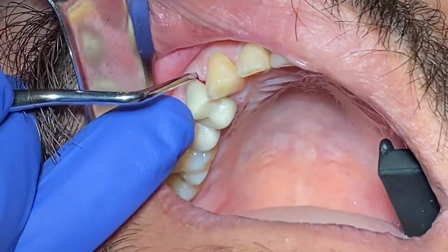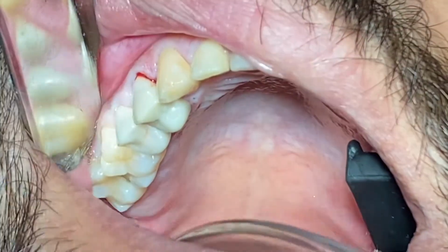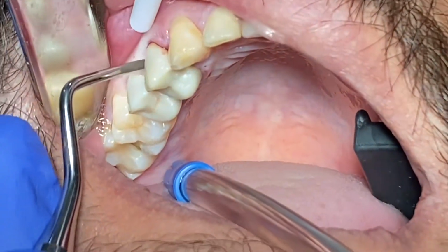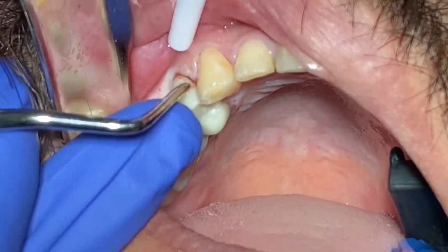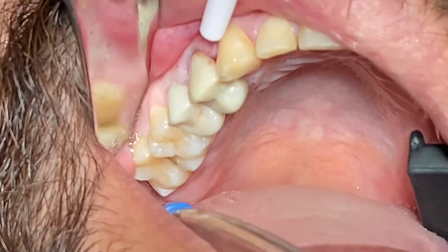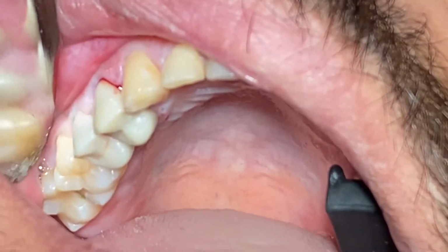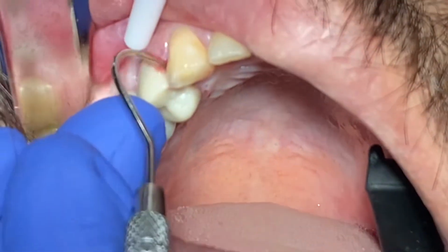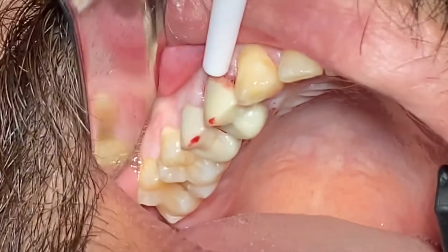I'm excited to give you a report regarding this journey of the tooth number 5 extraction due to root resorption, furcation involvement and root resorption. I have to take this tooth out, although it seems to be very strong and solid, but on the x-ray there is a lot of root resorption of the furcation area and the patient doesn't feel comfortable. See, continually having the symptom of dull pain and constant irritation with the bleeding gum on that area.